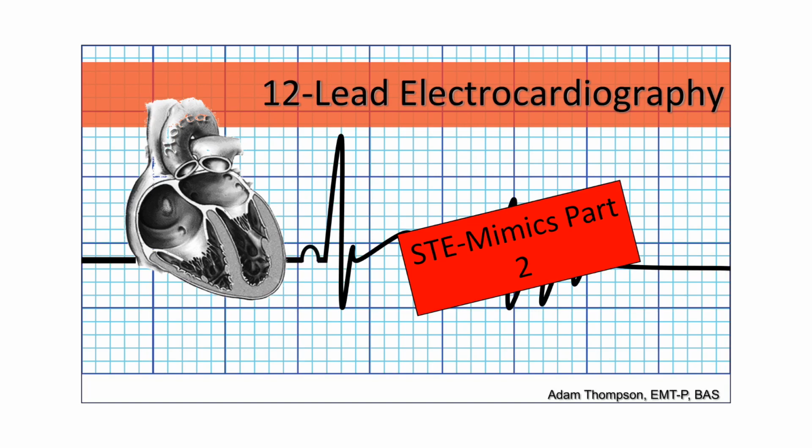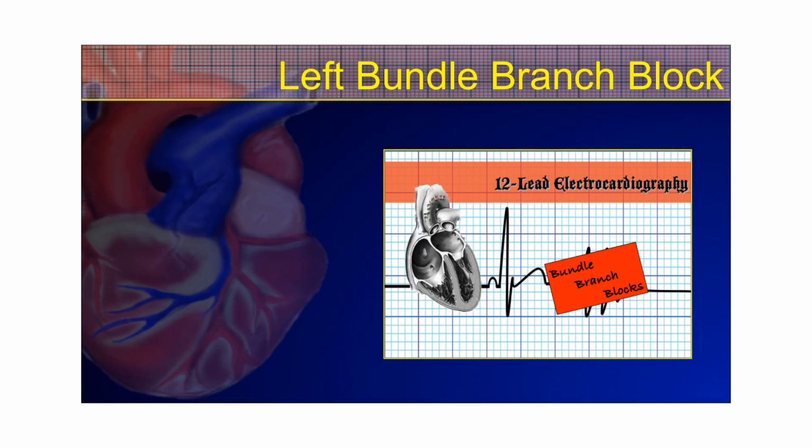This is the second part of STE-Mimics. And in this part, we're going to talk about different causes of STE-Mimics. But first, I want to remind you, if you don't know what bundle branch blocks are, head over and watch the bundle branch block tutorial on the Resuscitationist YouTube channel.